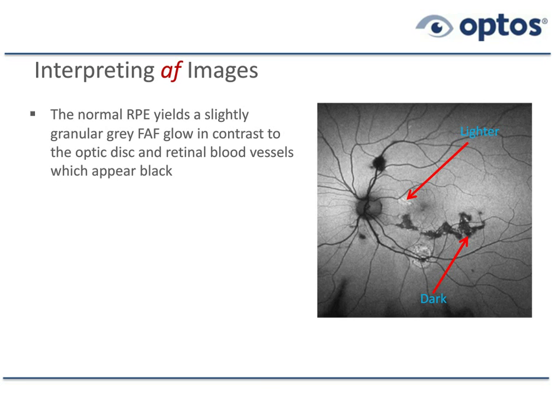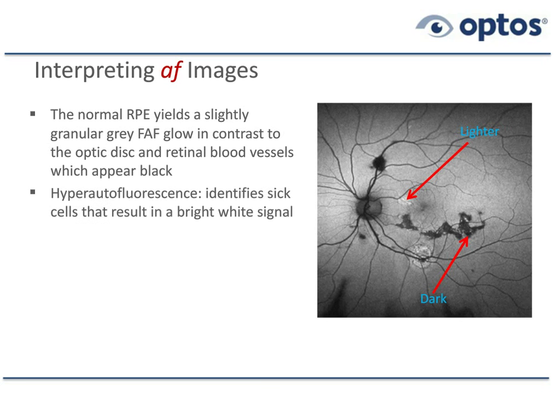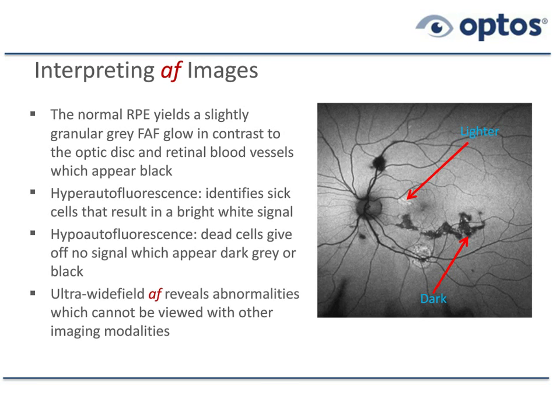Certain areas can be lighter — that would be an area of hyperautofluorescence. Below that, with a second red arrow, we can see zones which are dark — hypoautofluorescence. Hyperautofluorescence identifies sick cells that result in a bright white image; these cells are metabolically active or overactive. Hypoautofluorescence tells us about dead cells, which give off no signal and usually appear as dark gray or black. There are a couple of exceptions to these general rules.